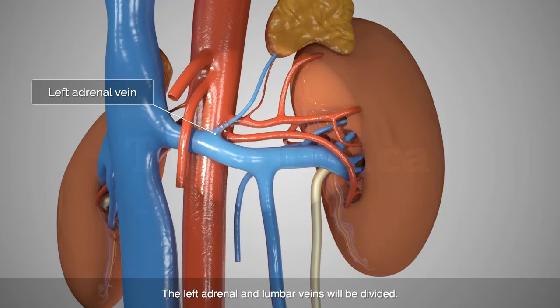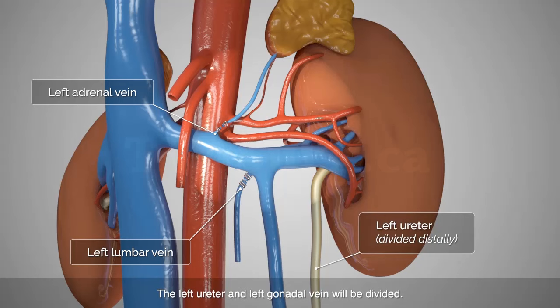The left adrenal and lumbar veins will be divided. The left ureter and left gonadal vein will also be divided.